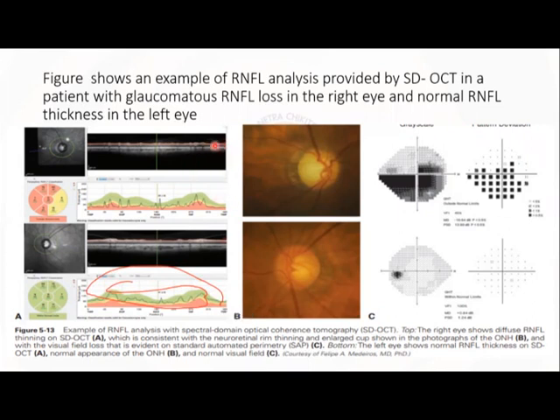Sir, this one, RNFL reading. Can you see anything if I am writing here? Yes, sir. So the part I am highlighting, the inferior RNFL graph, should be in a double hump pattern.